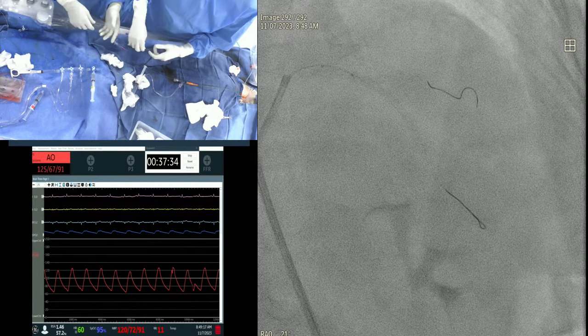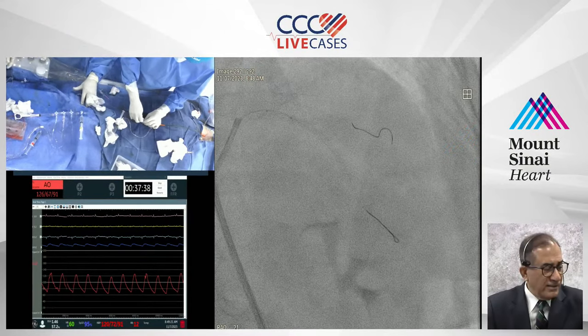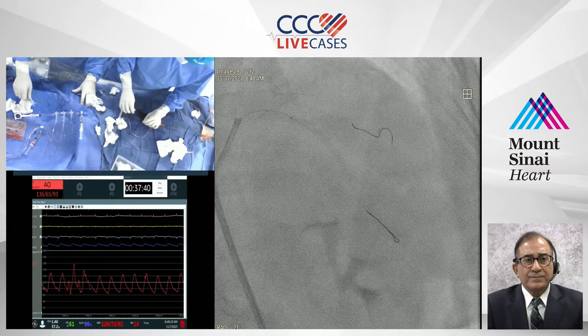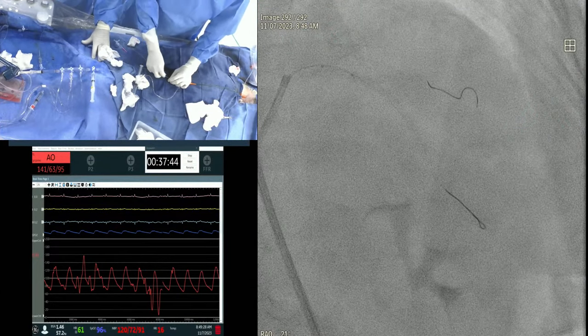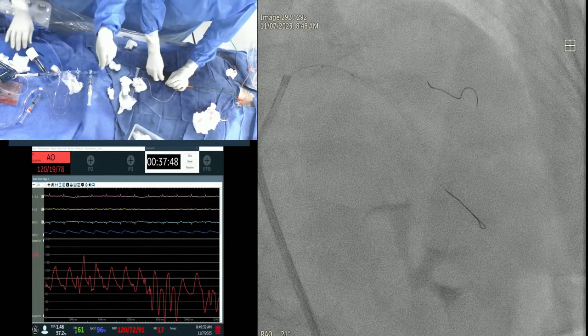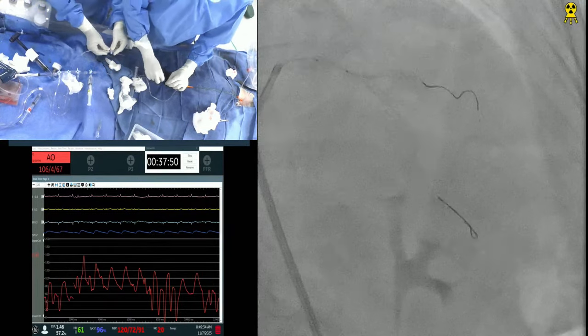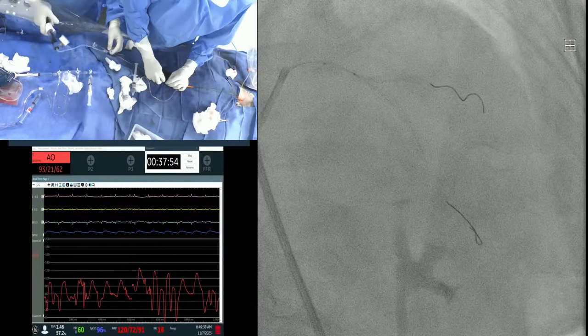Once again, a very observant audience. They want you to demonstrate the anchoring technique. Can you show the video of the anchoring technique? The app video of the anchoring technique? Felipe? Okay.